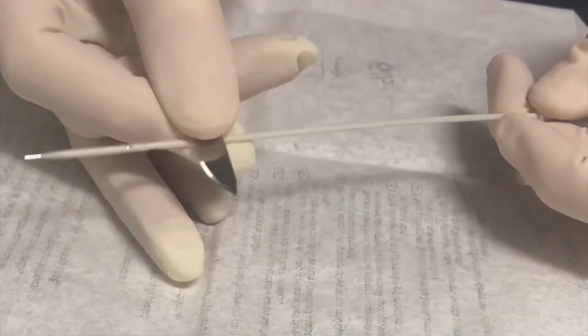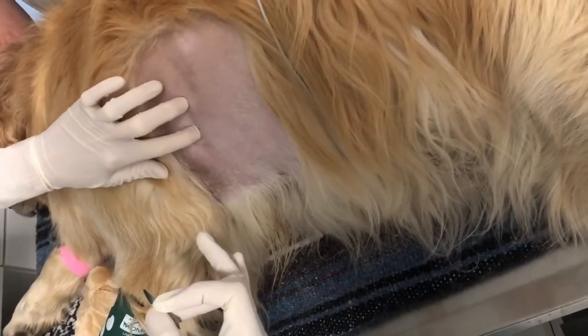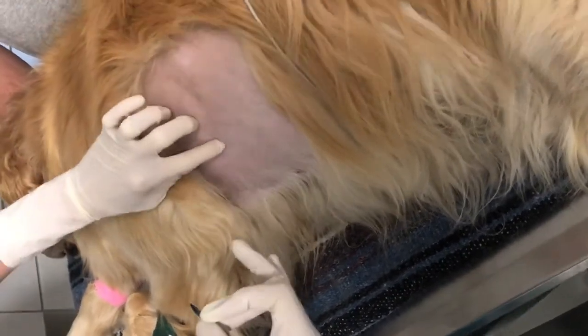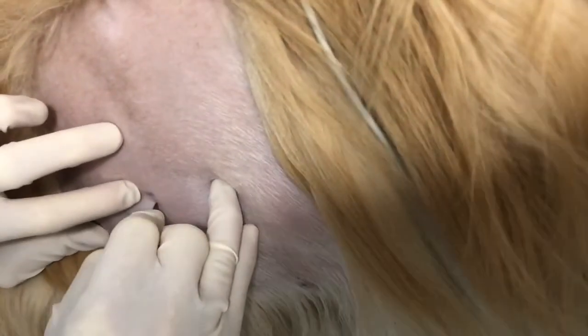At the selected intercostal space, remember that you will want to advance your catheter along the cranial aspect of the caudal rib to avoid the vasculature that runs along the caudal aspect of the ribs. Localize this site and then make a small stab incision over the site so that there will be less drag on the catheter as you pass it through the chest wall.